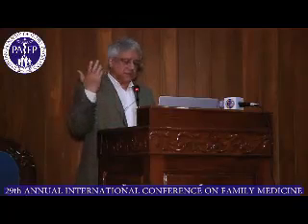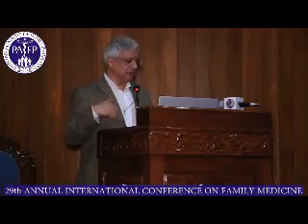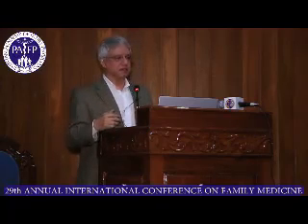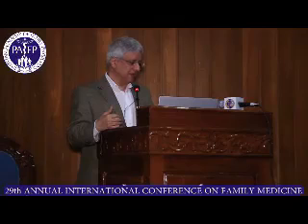The third thing is doing a complete workup in these patients who have stroke symptoms, involving the aortic arch, all the major vessels, all the way up to the circle of Willis. So you know what level and which level of abnormality you are going to treat, if there is any.